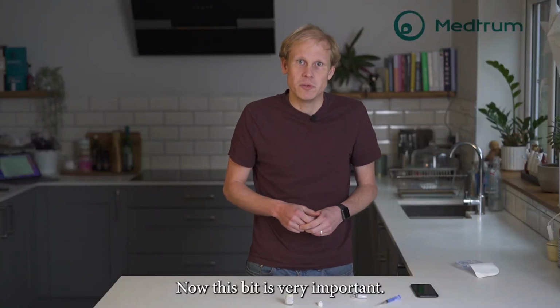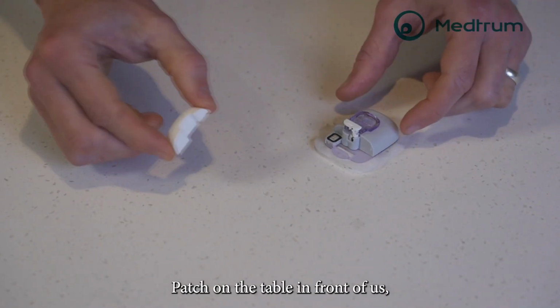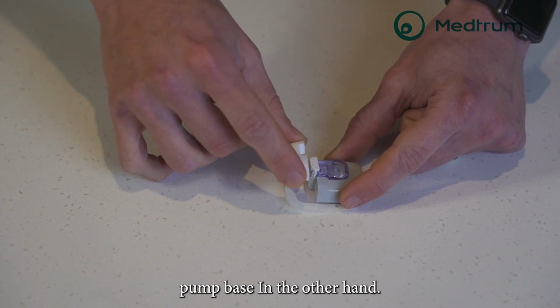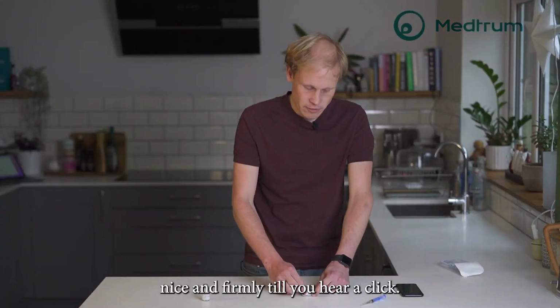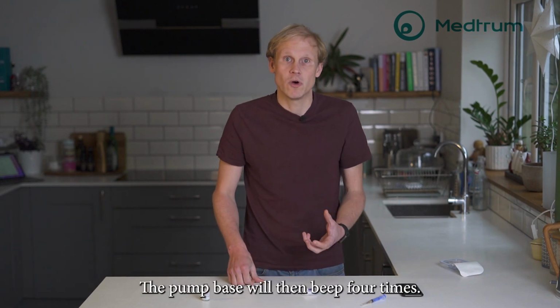Now this bit is very important. So the way we do this is patch on the table in front of us, pump base in the other hand. You line the two up directly from above and then push down nice and firmly till you hear a click. The pump base will then beep 4 times.